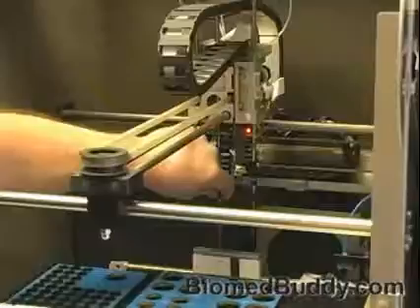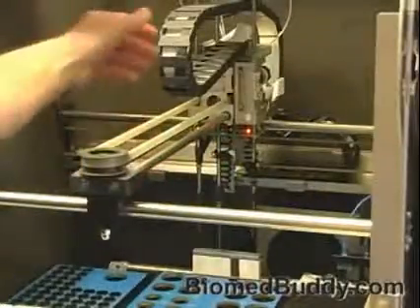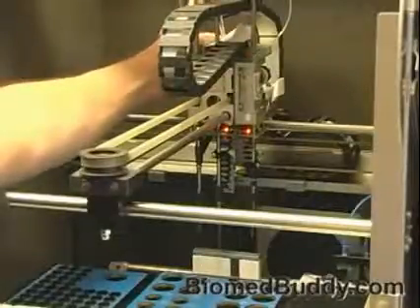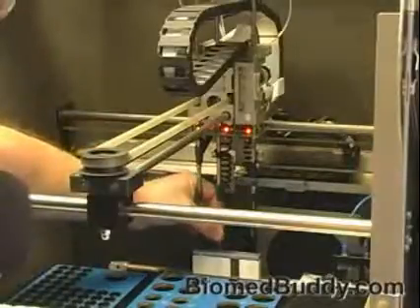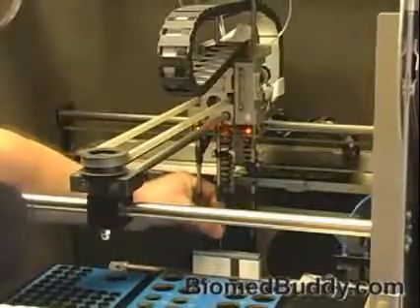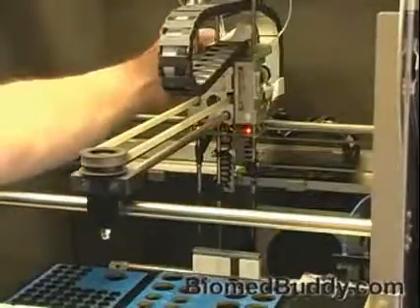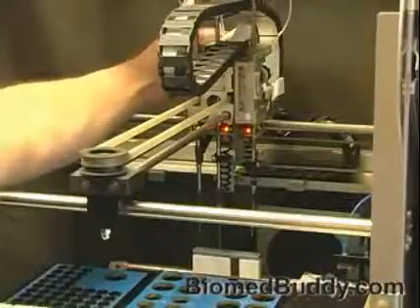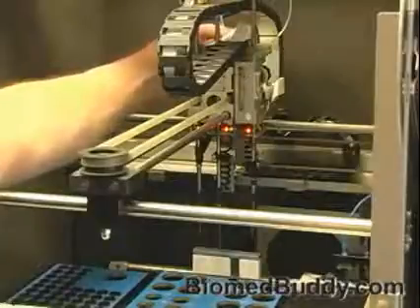You don't want to move the arm. You should have already, by the way, opened up the drawer at least once and closed it. Let the instrument do it because that would position it. Not critical, but yeah, that's what you should do. I just know because I went through endurance that the drawer has been opened and closed. And you see me bend it back a little. We're not talking about an awful lot. We're just talking about minor adjustments because there should be no kinks or anything in this needle.